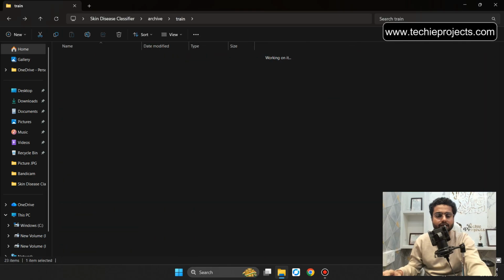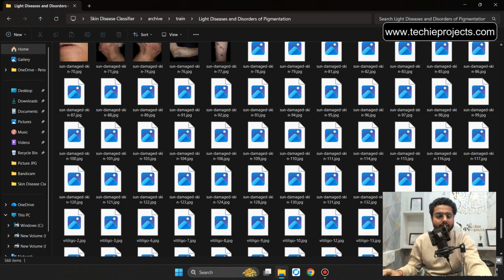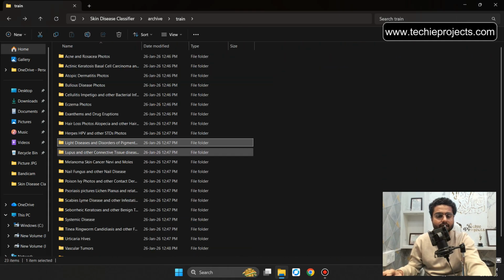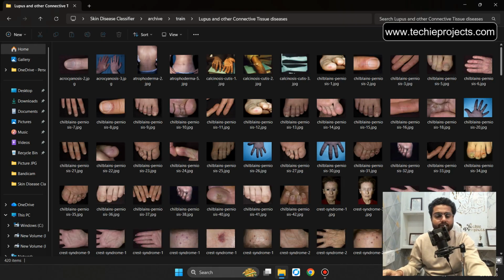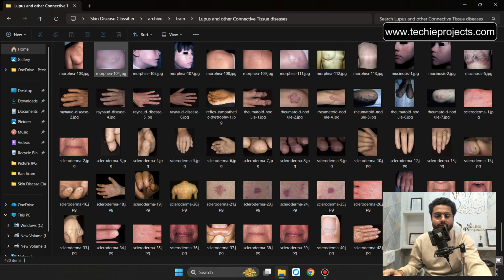Let's go back. Now this will be the light diseases and disorders of pigmentation. It will be around 568 images. Let's go back. Now this is lupus and other connective tissue disease. It will be around 420 images. So we have trained the model from those images.